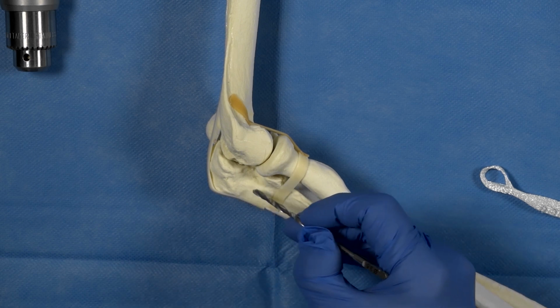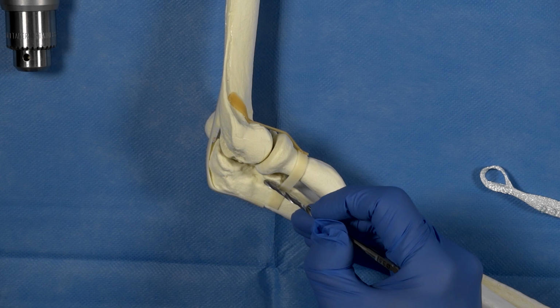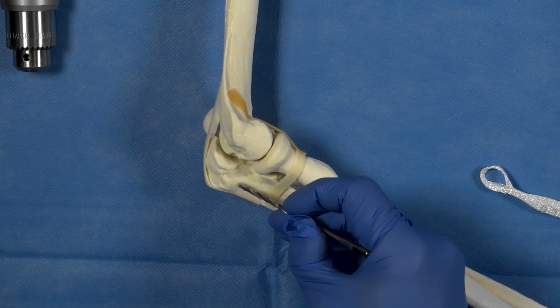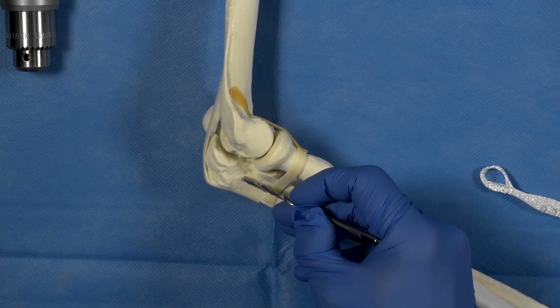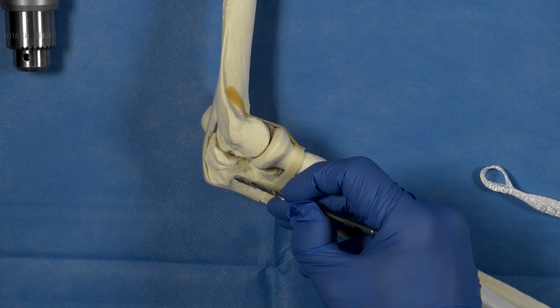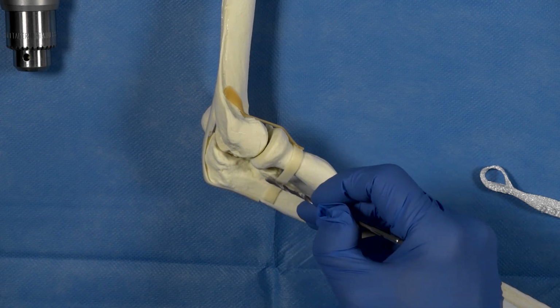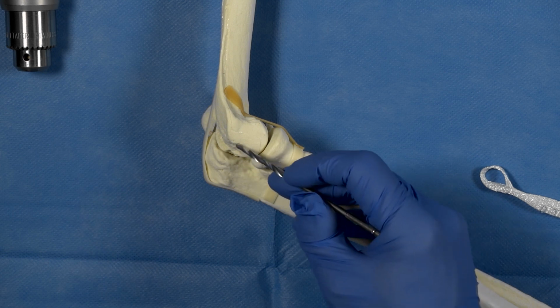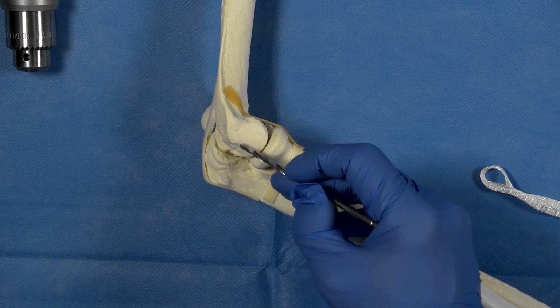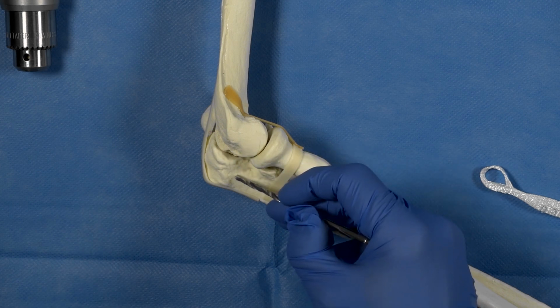And the secondary hole wants to be quite posterior, so it wants to be about 1 centimetre dorsal and 1 centimetre proximal on the ulna. And the reason for that is that we want to create a posterior band. We're going to have an anterior band, which is reconstructing the lateral ulnar collateral ligament, and a posterior band, which is reconstructing the posterolateral ligament, the Osborne-Cottrell ligament.